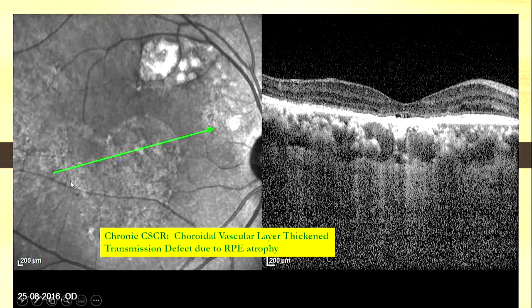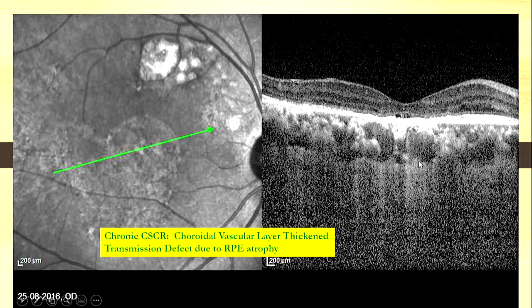This is a patient who's got chronic CSR gone into geographic atrophy. Some chorioretinal atrophy is occurring, and because of that there is more transmission of light — you see this? Because the RPE is gone, there's more transmission of light.